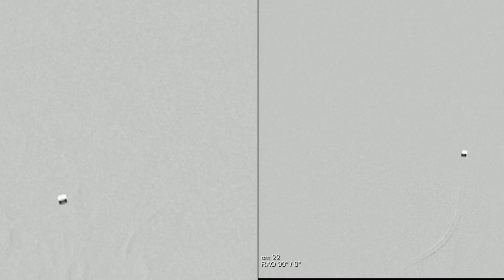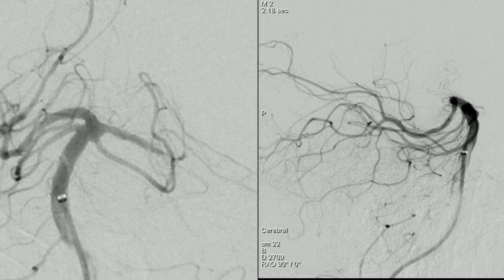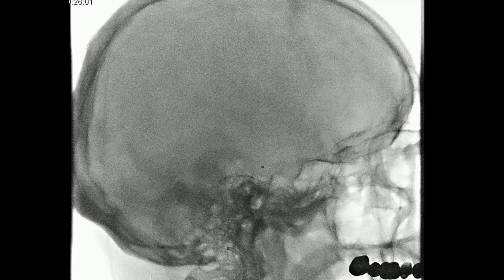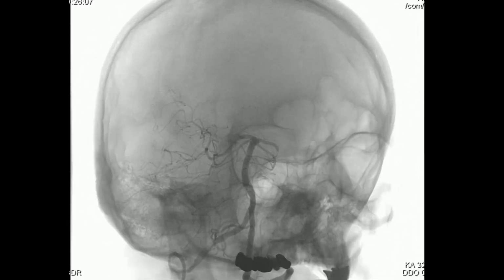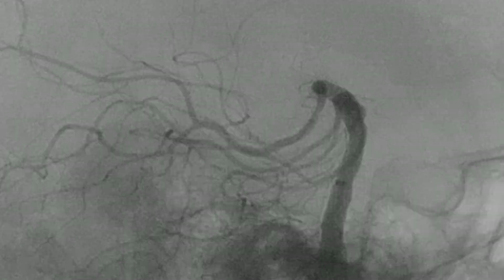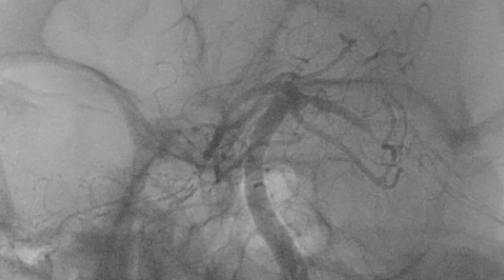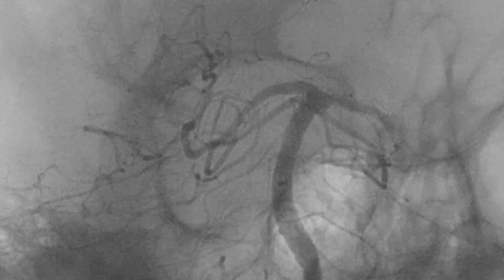And as you can see, it's recanalized, but we still have a high-grade stenosis, which will get occluded according to our experience. We perform a 3D angiogram to see the stenosis and to adjust our working position. And as you can see, it's a high-grade stenosis of the left PCA over a long segment, P1 to P2 segment of the left PCA.